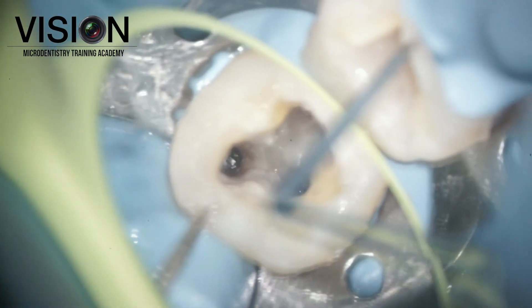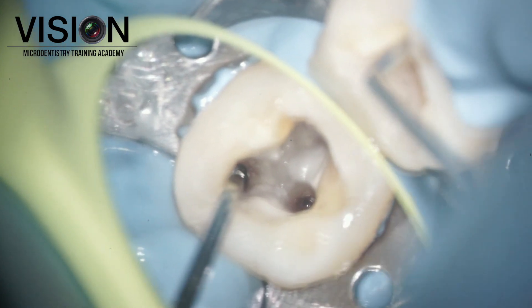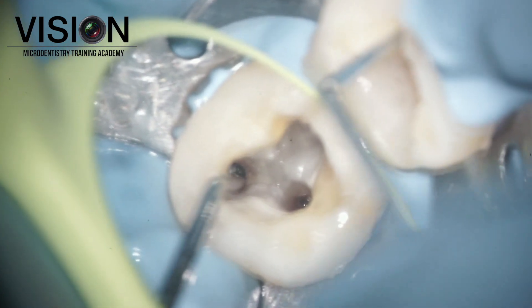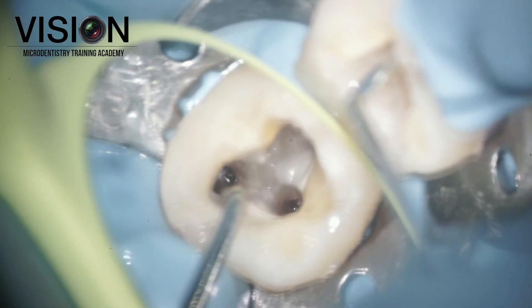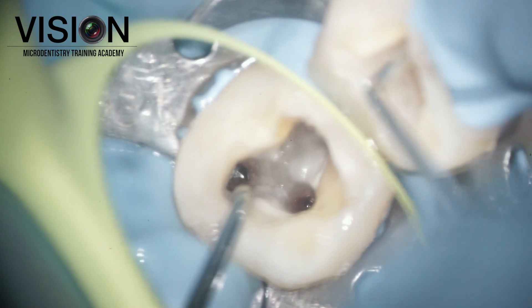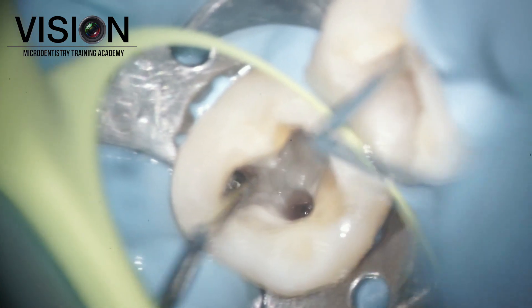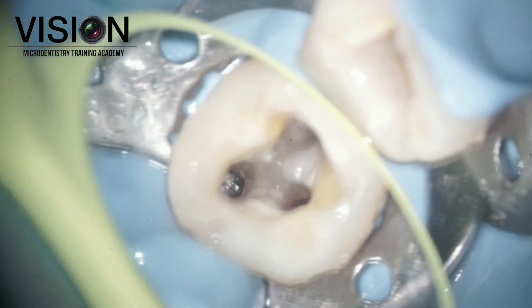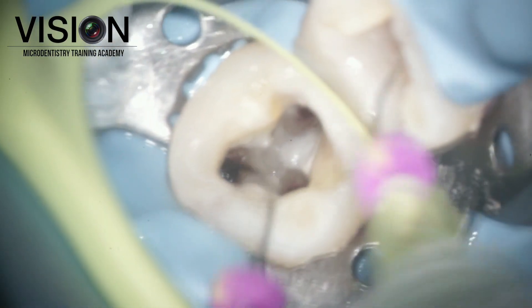Unfortunately, due to the long length of the head, even though the head was exposed, I couldn't get the instrument to pop out. So I used the DG-16 Explorer to check if the instrument was loose, and as you can see, the head of the instrument is moving but the tip of the file was firmly bound inside.